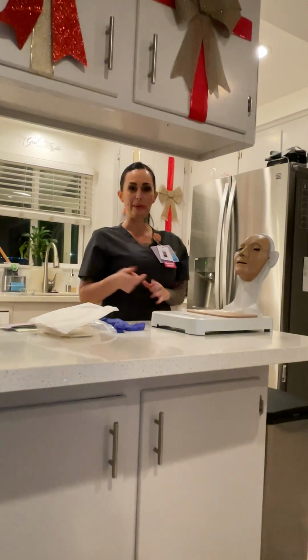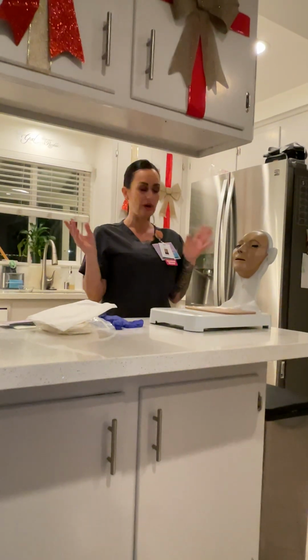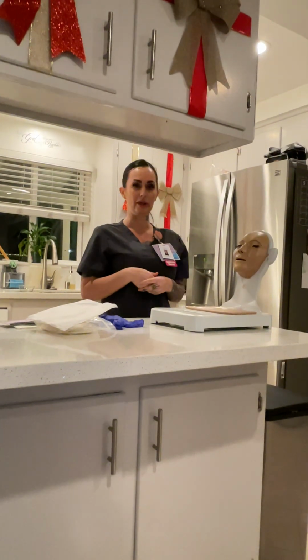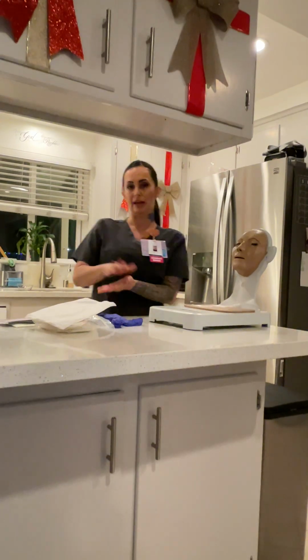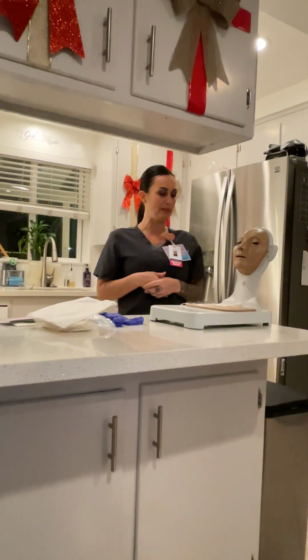I will be entering my patient's room. I'm going to close the door behind me for privacy of the patient, or the curtain if there is one, and I'll be performing hand hygiene once I enter the room. At this time, I'm going to introduce myself to the patient.